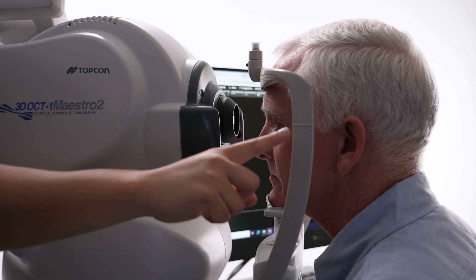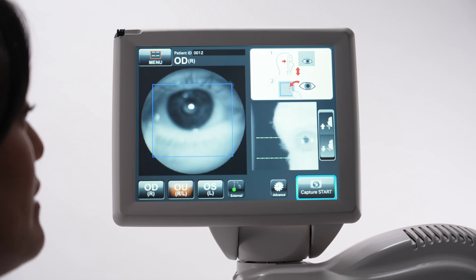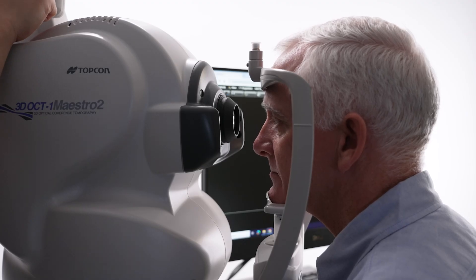The outside corner of the patient's eye should be level with the canvas marker on the chin rest post. If it is not aligned, use the controls on the touch screen to adjust the chin rest height.